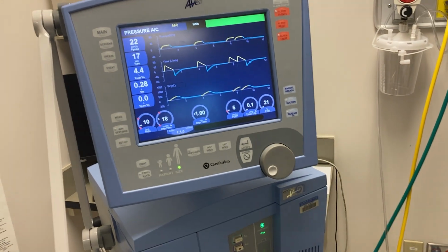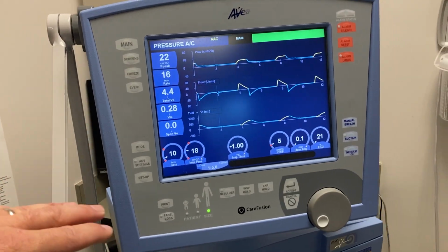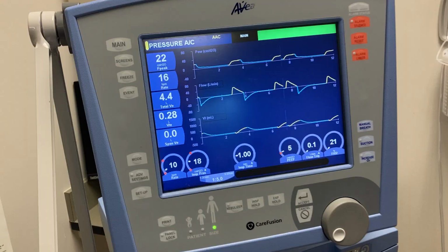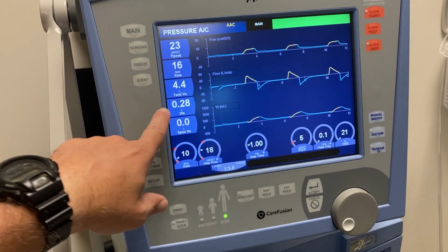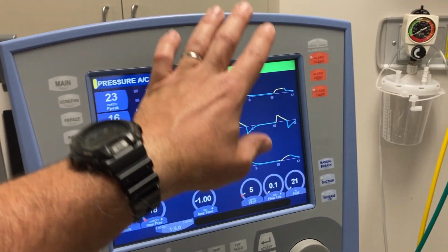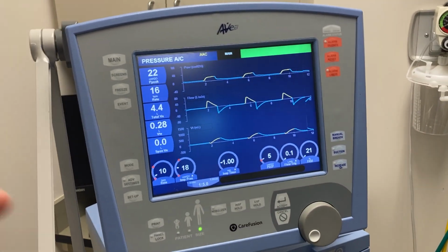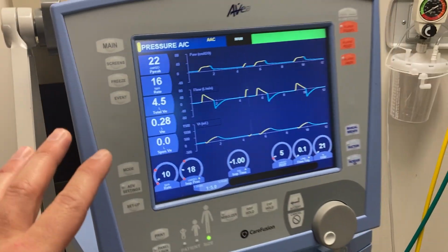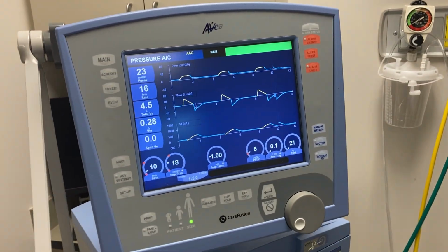Under normal circumstances, and just because I've been playing with it a little bit before turning this video on, I know that at a rate of 10, inspiratory pressure of 18, PEEP 5, my exhaled tidal volume should be in the ballpark of about 0.28 or 0.29. Those exhaled tidal volumes, because in assist control, pressure control, even though these are patient triggered, they're still mandatory, controlled, or ventilator breaths being delivered. So in this case, the patient's saying, hey, I want more of what you got. But the patient's not really saying that. It's giving more of what it's got because the flow trigger is set inappropriately.